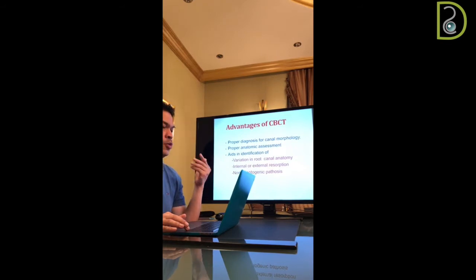Why do we need CBCT? We have to know the variation of root canal anatomy, internal resorption, external resorption, or we can think about whether we have any relation to a dental problem or there is no relation to a dental problem.